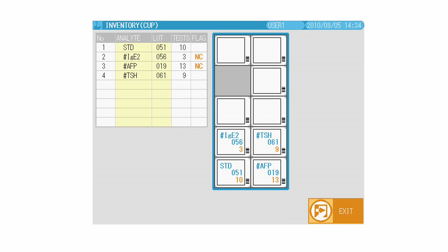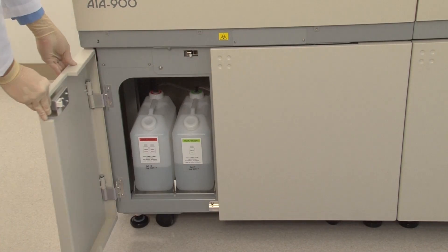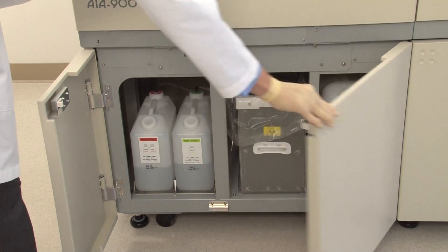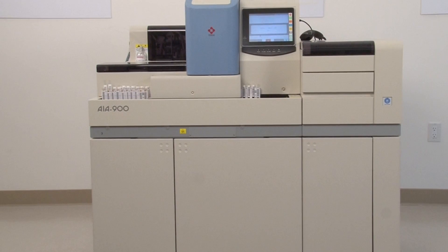reagent supply, consumable stock and waste volumes, which enable the operator to check at a glance which items need to be replenished or emptied. In just a few minutes, the system is ready to run samples.